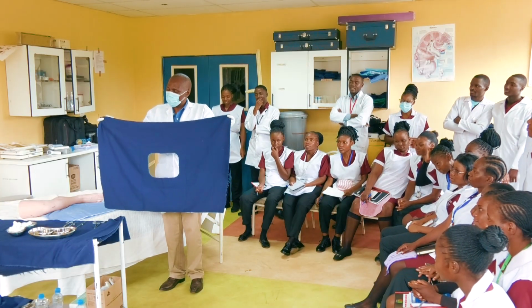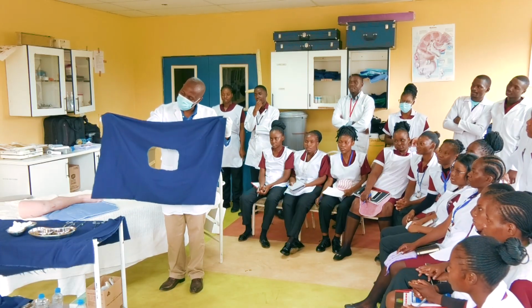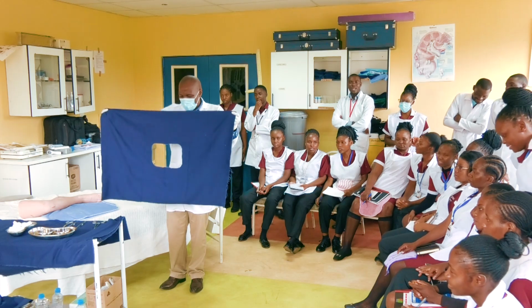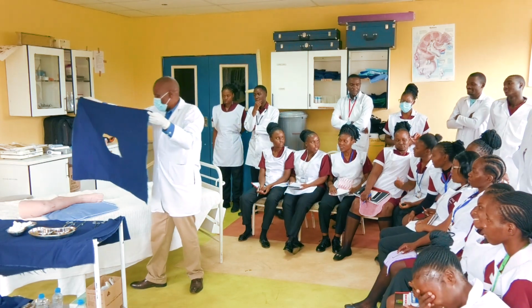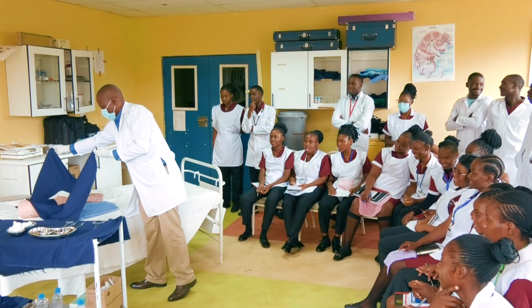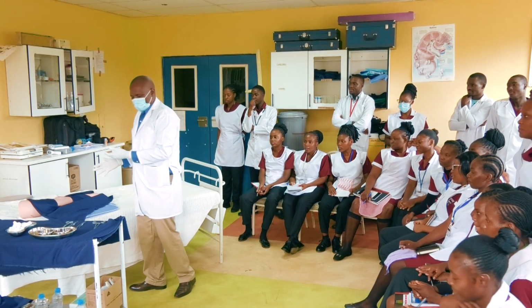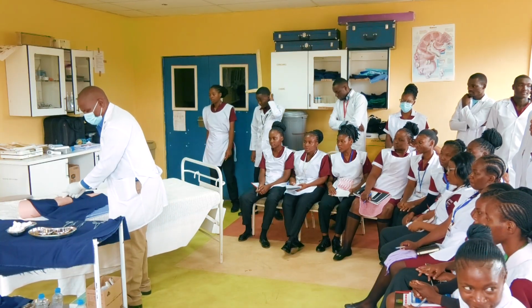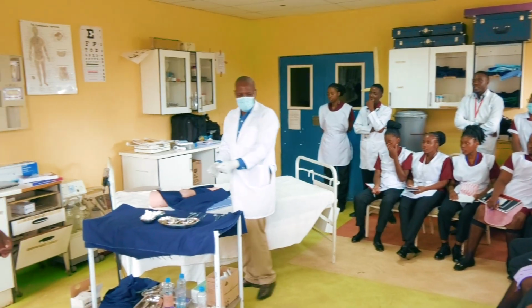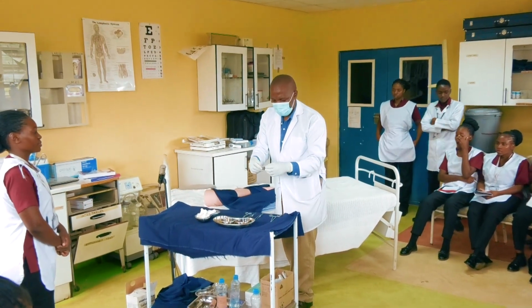So the one that's supposed to be up is this other side, because anything that falls on this other side, I can reuse because it's still sterile. So that's why the one that is close to me is the one that is less sterile. I'll make sure that this area remains like that. I can even move a receiver and put it here so that I don't move up and down. Clear? Okay. So let me just prepare this.